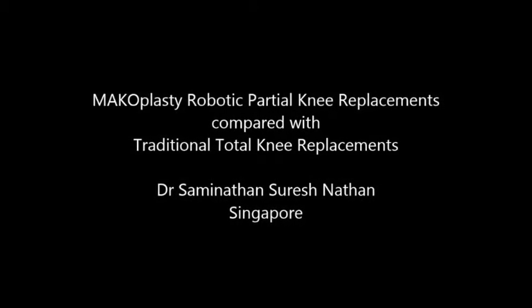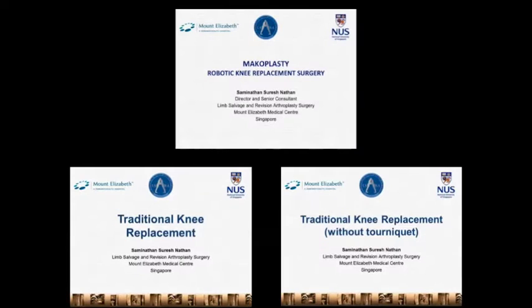Today I thought it would be interesting to present a comparison of the robotic technology in knee replacement surgery, known as the Makoplasty using the real robot, with a traditional knee replacement, and draw some conclusions about what the technology brings to the patient who is a candidate for knee replacement surgery. I must stress this isn't a biased advocate of any one of these technologies. I try to present a neutral representation of technologies in how they may be applied.